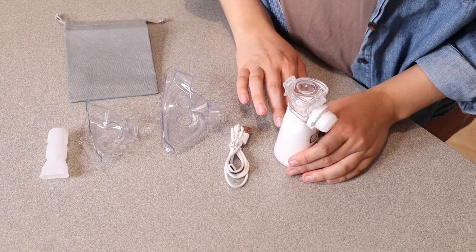Right here we have this portable nebulizer. This is for both adults and children. I'm going to go ahead and open this up and show you everything it comes with. This is everything that came inside the box besides the user manual.